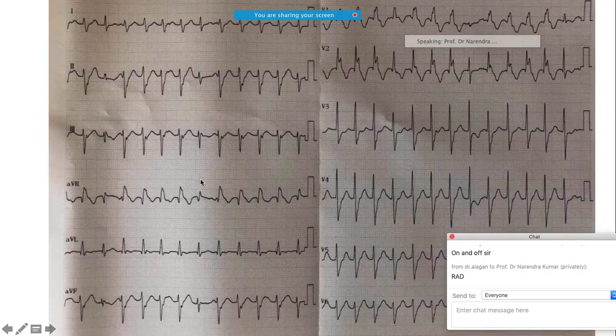And if you look carefully, over here we are able to notice a P wave. P, QRS, T is there as well. But after that, we don't see any P over here, right? Similarly, over here, in this other beat, we are able to see this P. So this is what is called VA dissociation, in fact. And if you keep on looking at this QRS in a continuous way, what is happening? Over here, there's a narrow QRS, right? This is wide, narrow. This is again wide. So this is what is called a capture beat.